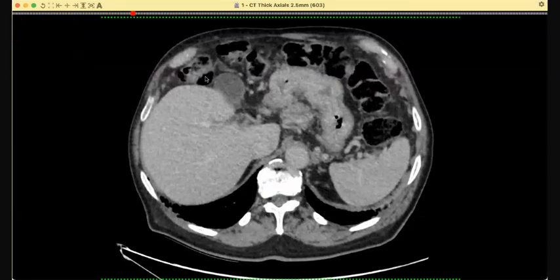81-year-old female, vague abdominal symptoms including vague pain, flatulence, etc. So they had done a CT abdomen and ruled out any cause, any obstruction, any diverticulitis, vague symptoms, vague request. Over to you. Okay, sir.